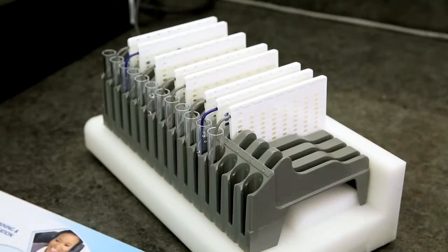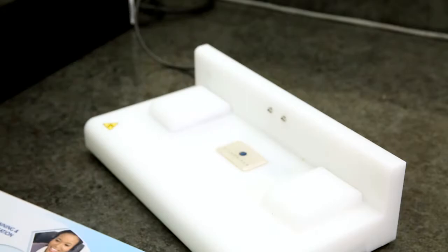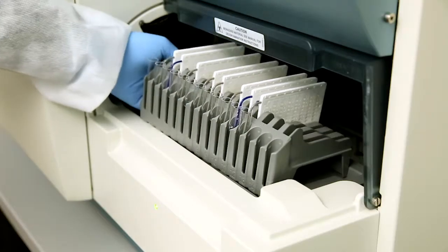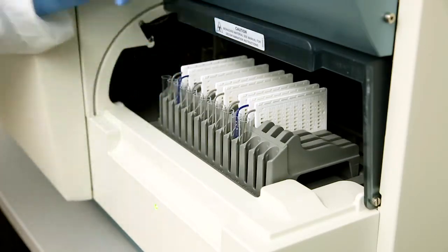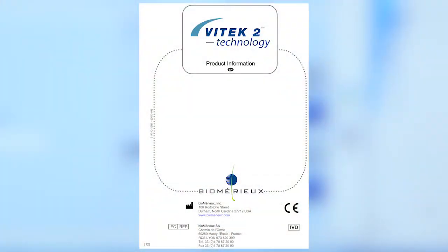Once all inoculums are prepared and placed in the cassette, and all data has been entered and verified, remove the cassette from the docking station and load it on the VITEK 2 instrument. Note: refer to VITEK 2 Product Information Manual for VITEK 2 test card setup procedures.